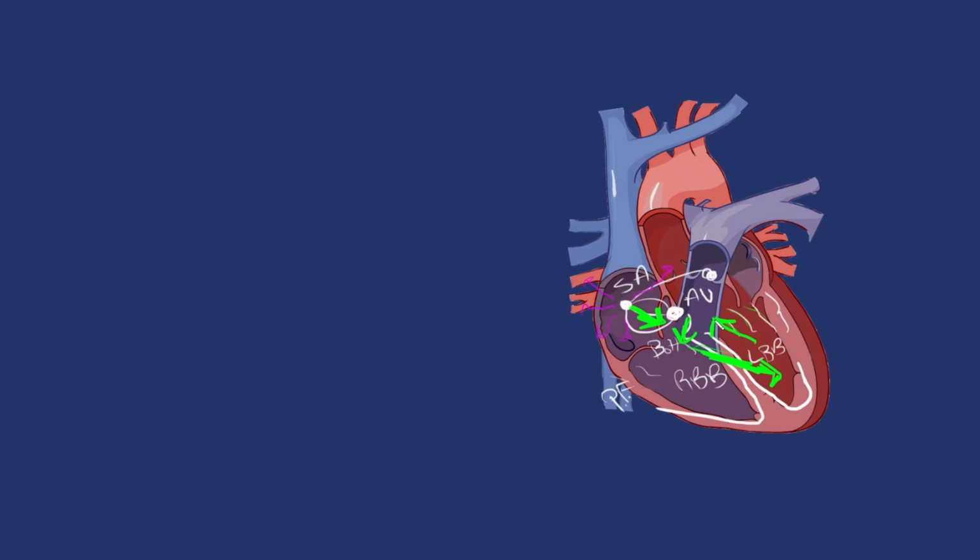And now that we have these arrows drawn up, hopefully things can make a little bit more sense, and we can add in an electrode. For the sake of this, we're going to keep it simple and just add in lead 1. If you remember, lead 1 had a negative on the right arm and a positive on the left arm. We're just going to draw a little 1 here and draw this over to the side, just along this x-plane. So if we were to take all of these lines down and draw them down, this is where we're going to get our EKG.